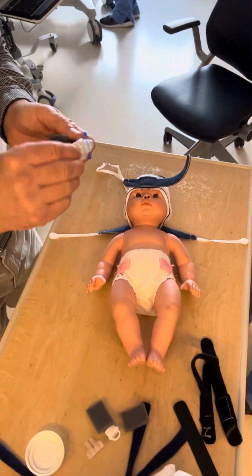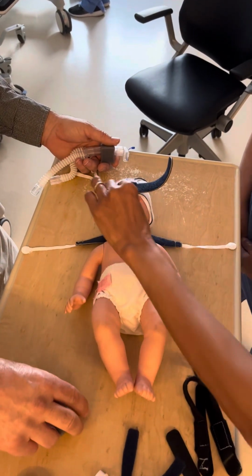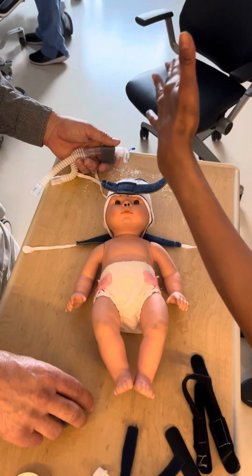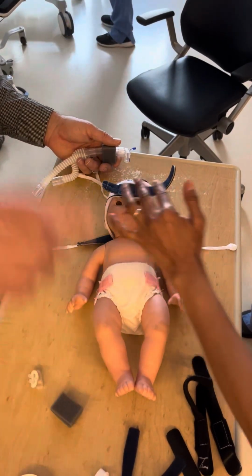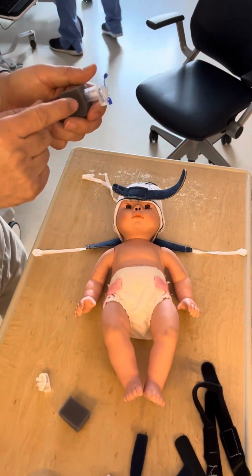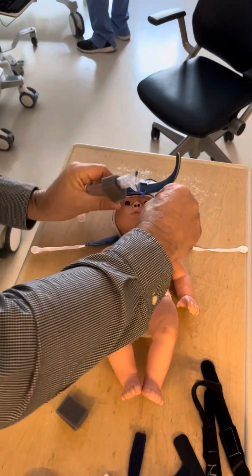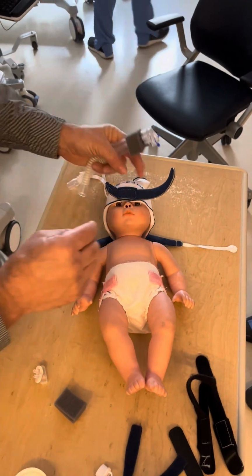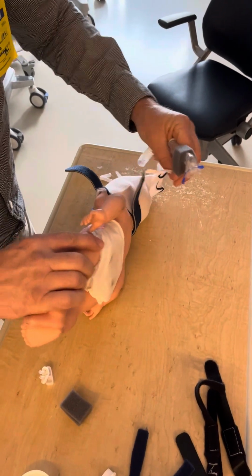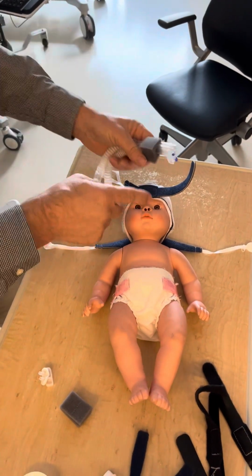This nasal tubing, I'm going to make it a little difficult because I use this a lot and I actually like them. When you do put this on, sometimes if it's not level the right way, this is pushed almost toward the eyes. I'm going to get to that. There's a way to pull that back, and it really has to do with this foam block. I'll show you a technique, because sometimes this looks like that. We don't want that. But we do want it down past the ears, and we do want it at the base of the neck. When we get to putting this on, I'm going to show you a technique to make sure it stays off of the eyes.